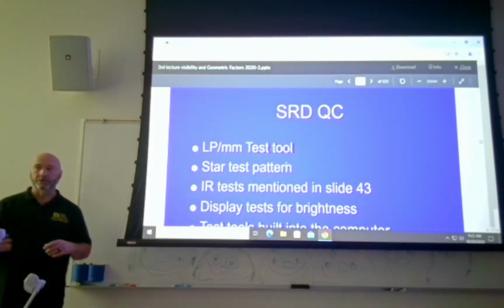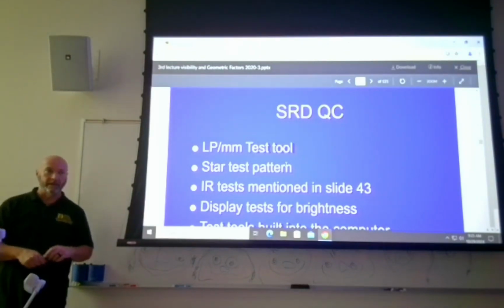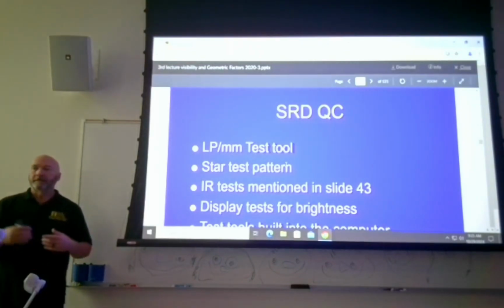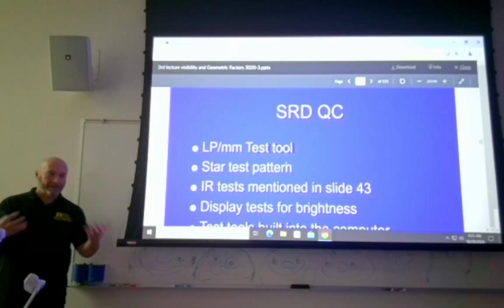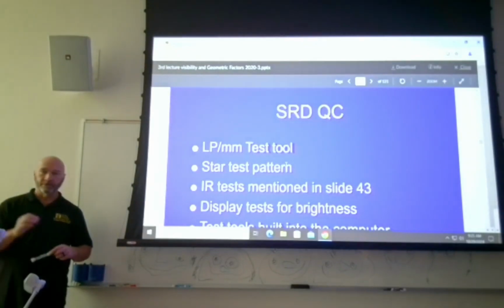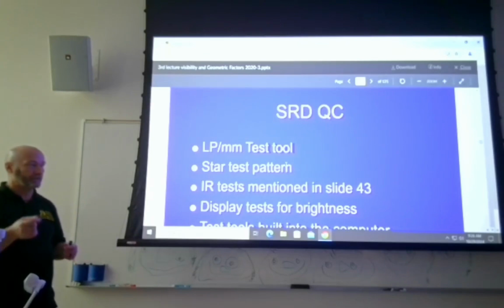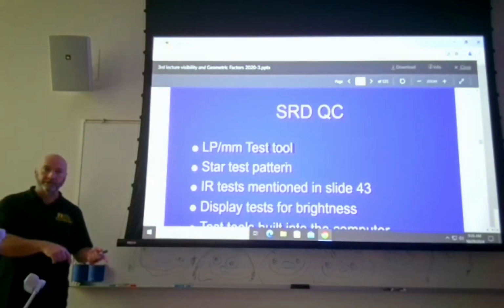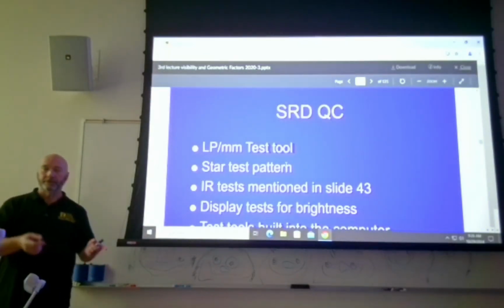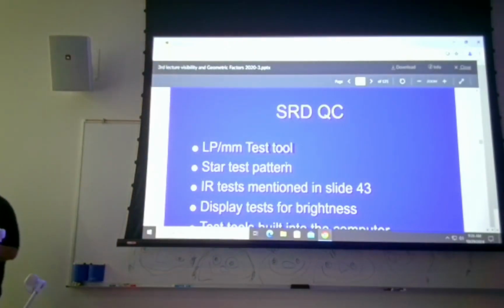You can actually post-process some things off of the image that the radiologist would need to see. So if you really feel like something needs to be processed, if you feel like you need to do some tweaking on the image, what you need to do, to send that image to the radiologist, is save a copy of the original, tweak it, and then send them both, right? Because your image is going to look totally different than the radiologist's.